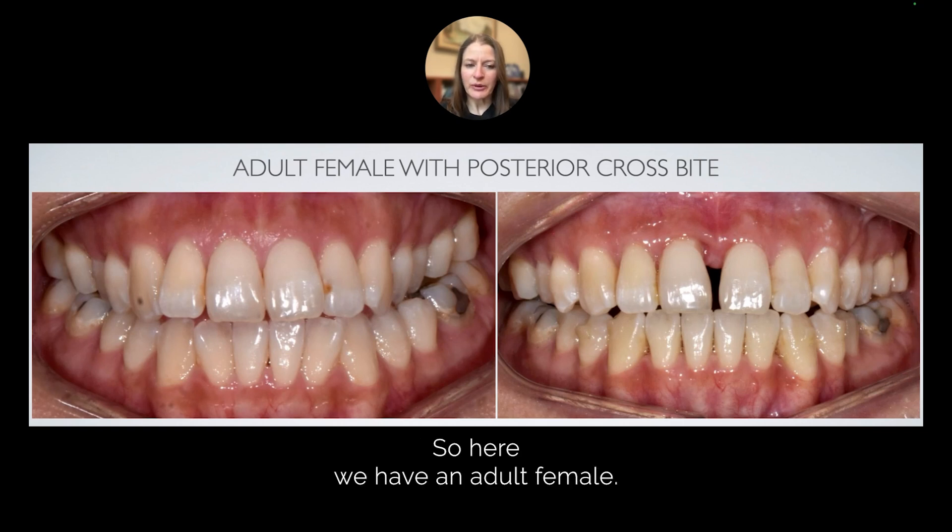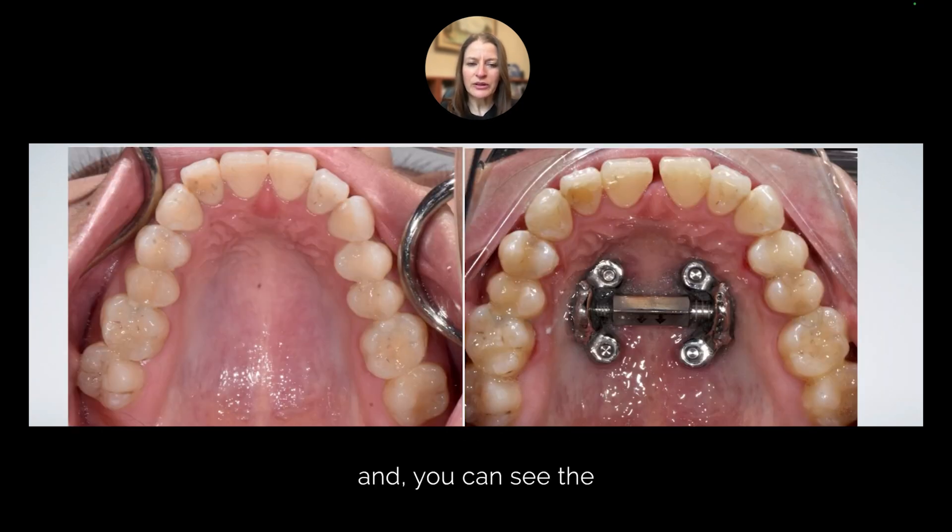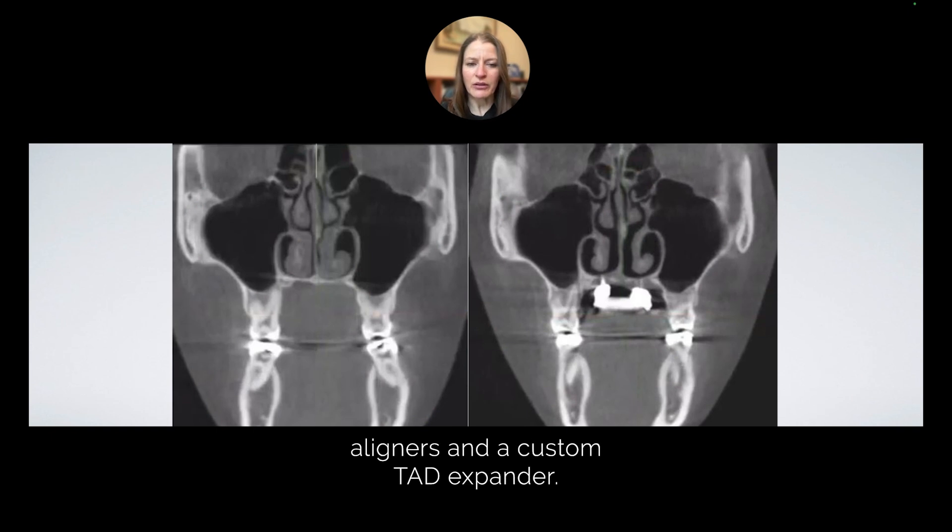Here we have an adult female. Here she is after we have completed our turns, and you can see the very customized design that we use today. We can predictably treat her case with aligners and a custom TAD expander.